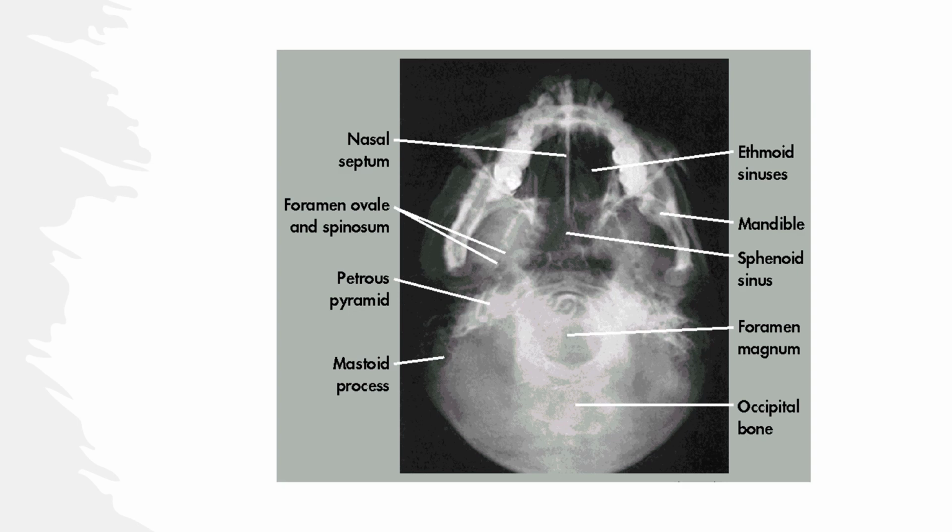You remember the Reach toothbrush commercial? It was the cartoon drawing, and the guy had a flip-top head to brush his teeth. That's exactly what you need to pull off a proper position of the submentovertex projection.